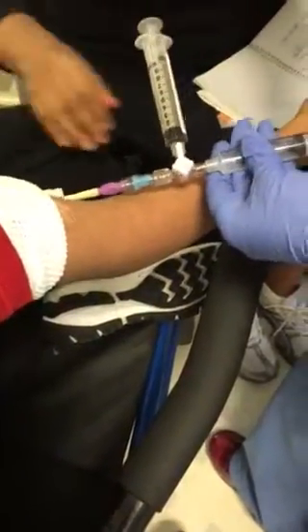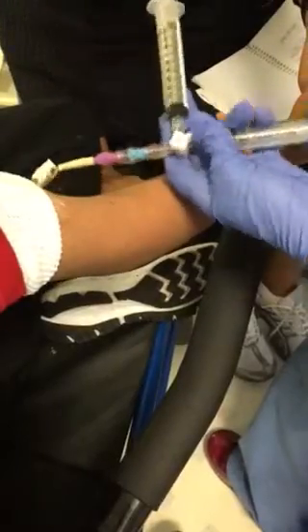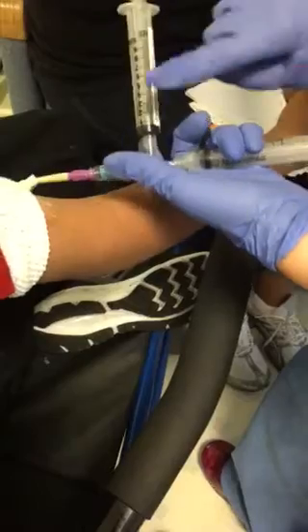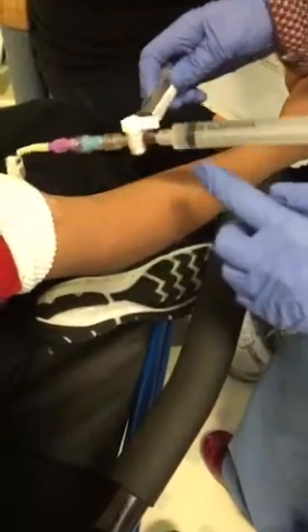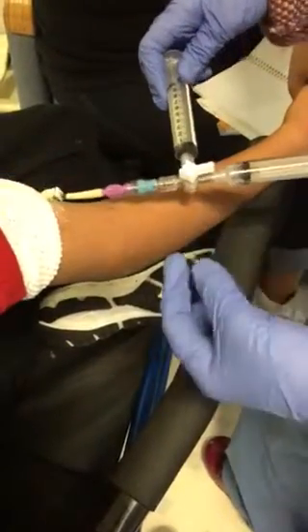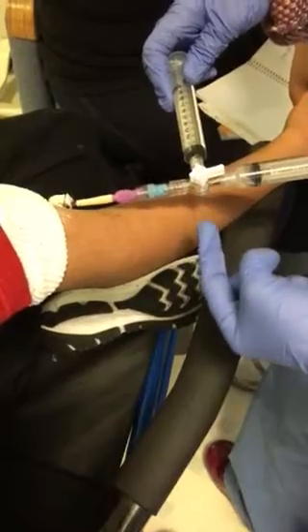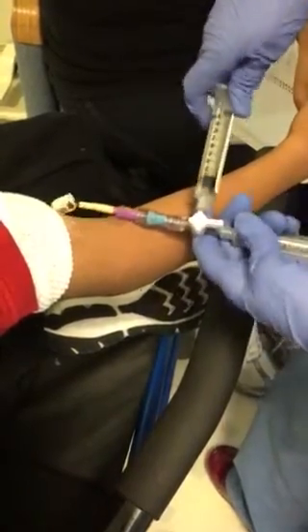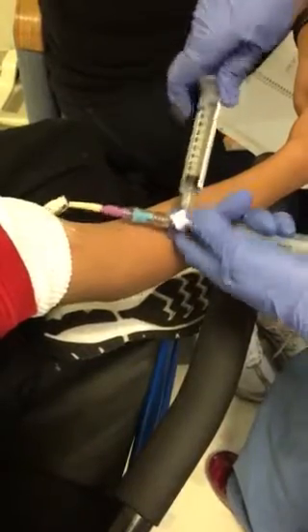I'm going to do it again. And I'm going to keep doing it until all the tPA is out of the original syringe. So now I have that cc in here. My hope is that part of the tPA has gotten sucked into the catheter. So I'm going to do this repeatedly.